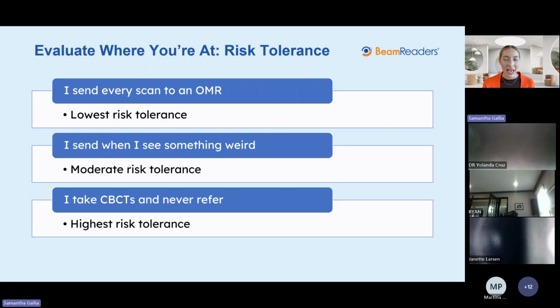I think we mentioned this last time, and just see what happens. Go ahead and practice writing a report, practice going through the scan yourself, then compare it to the radiologist report and see if they're catching anything that you're not. And if you're getting everything, then thumbs up. You're probably at a great place.